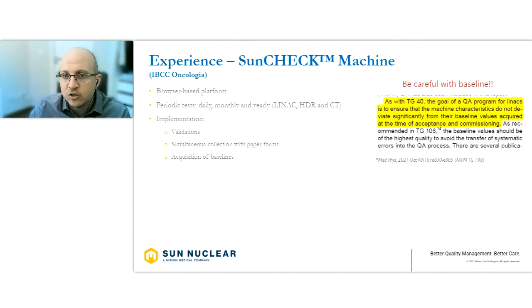And I would like to recommend considering the MPPG 8B. That's a recent publication that has an excellent discussion about the reference data for QA. So it's another important publication to consult for baseline acquisitions.